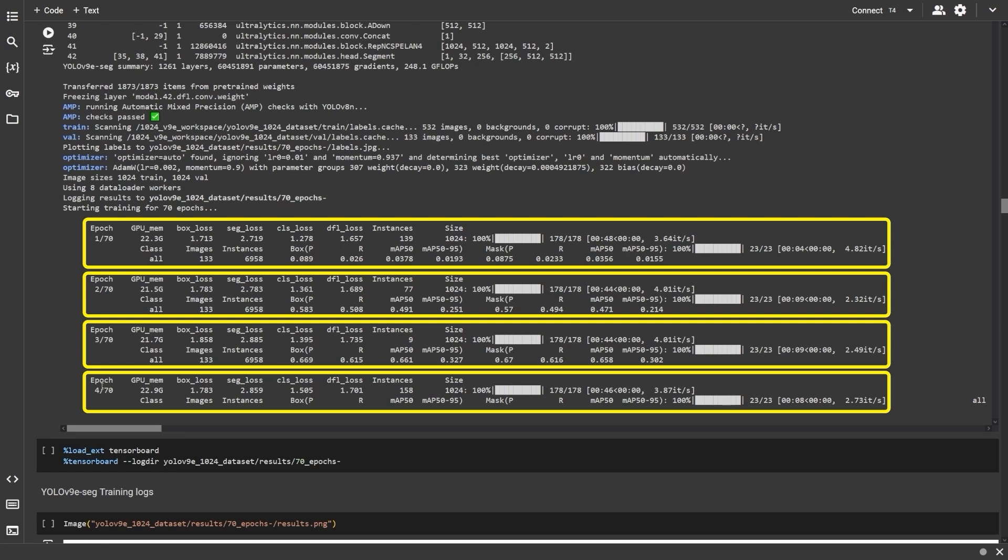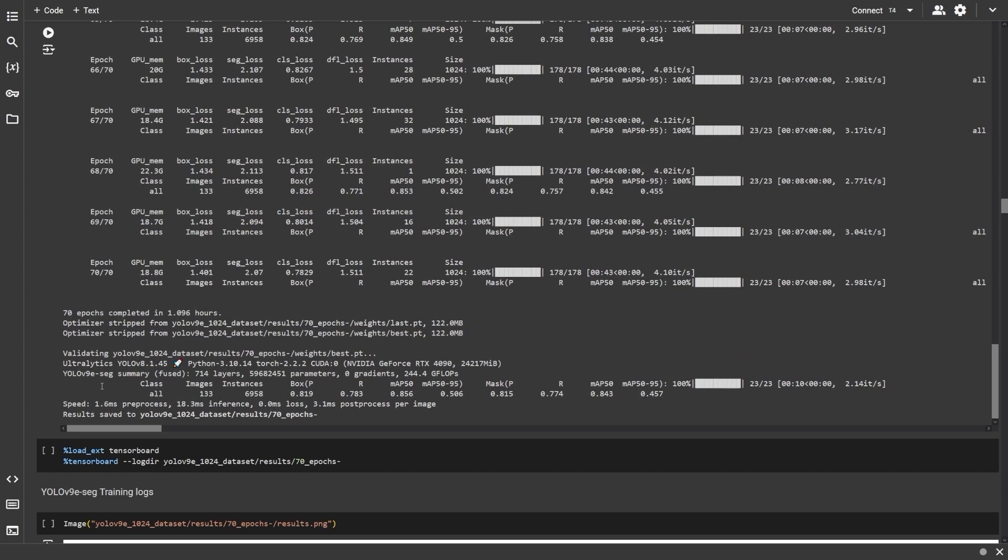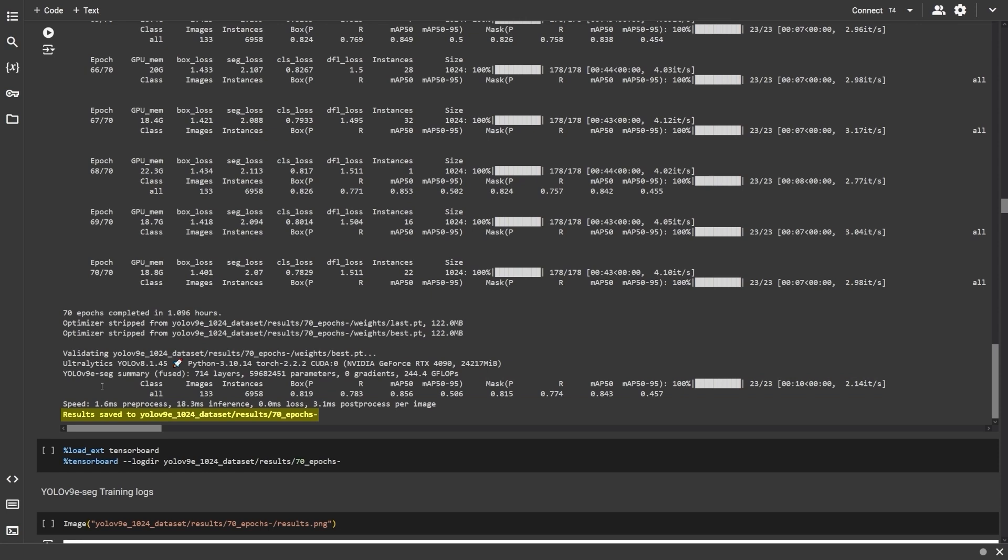Once the model is trained for an epoch, it will validate the model and output the box and mask metrics. And then, train the model for the next epoch. At the end of the 70th epoch, the model is again evaluated with the best weights and the results are saved in the project directory.